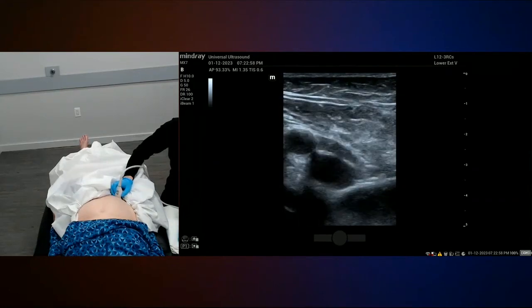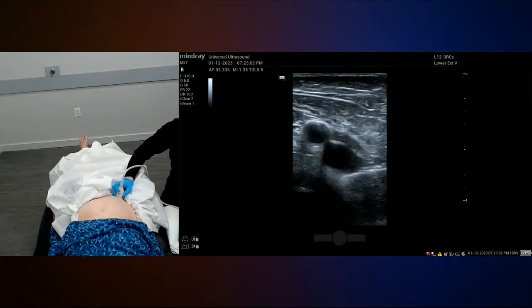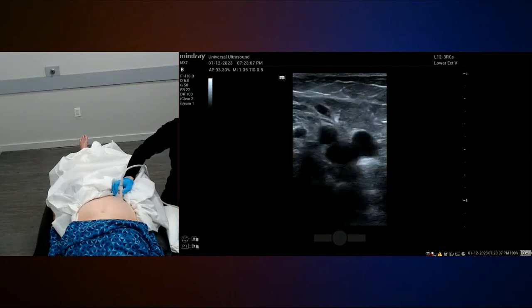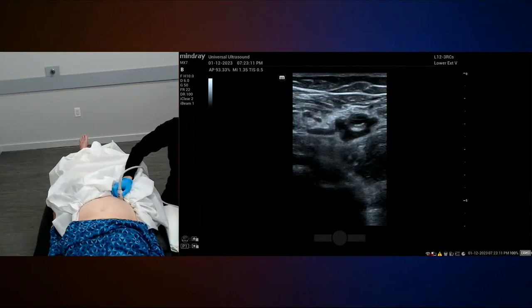So you always want to start above the femoral head, right? So you want the vein to be right next to the artery, and I'm going to press down. So that's common femoral vein. Again, this is mid, and then the confluence distal is right here.